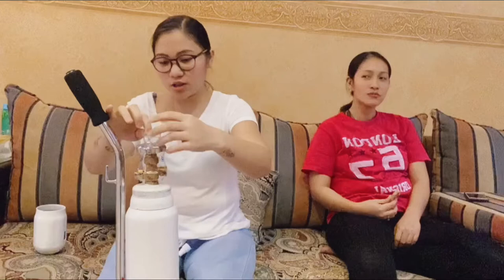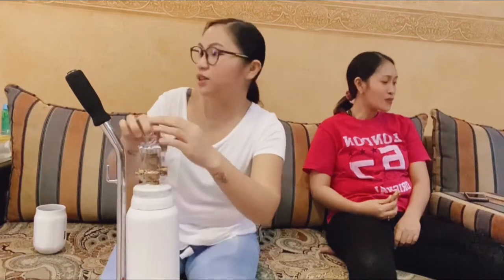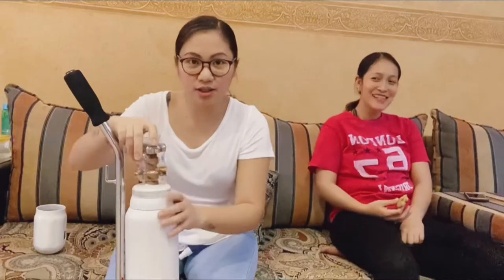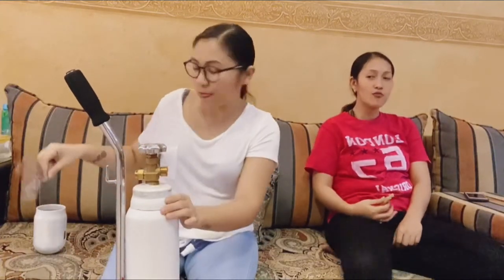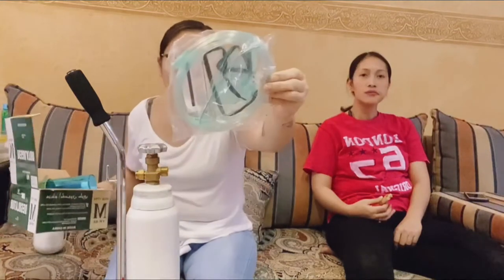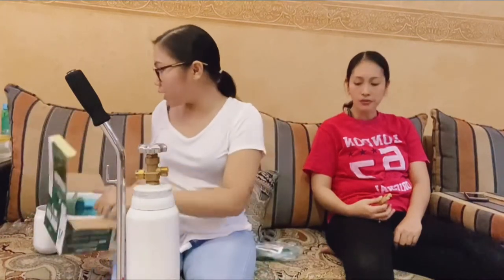First, we have to open this. We are in quarantine, guys. Me and Len are negative, but we have symptoms. So I have a regulator here, guys, and I have two tubes. We have this tube — I'll just choose which one you need.